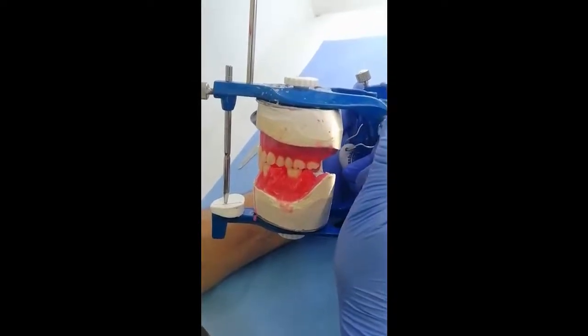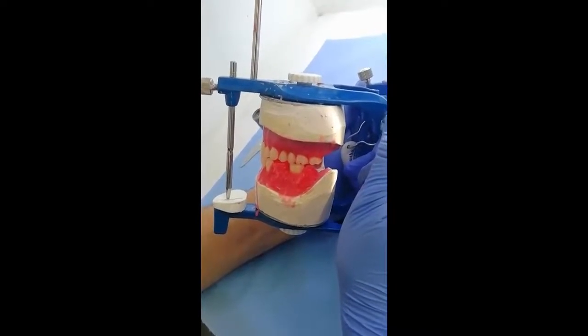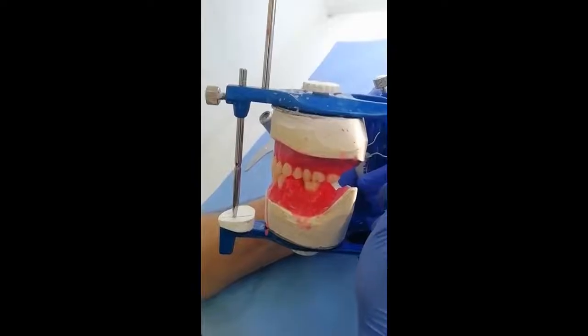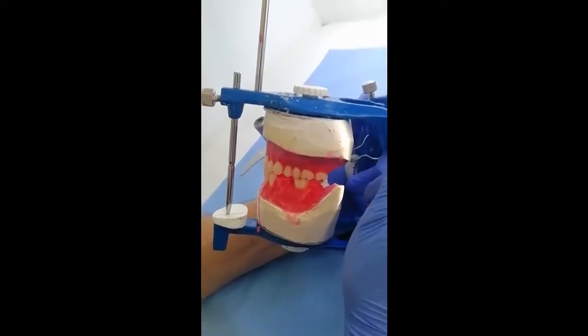We have to have a balancing contact between the mandibular first molar and the opposing teeth. Now you can see here we can put an edge to edge without separation of the pin, and we have balancing contact.